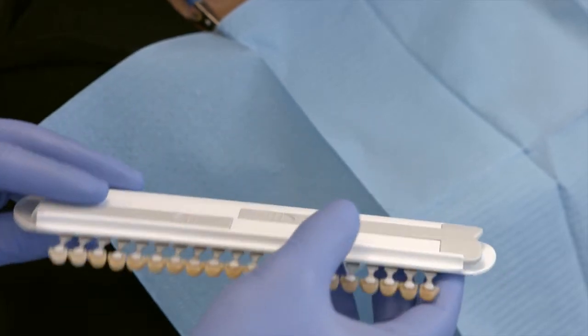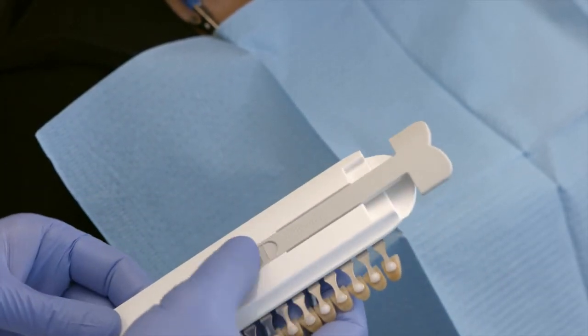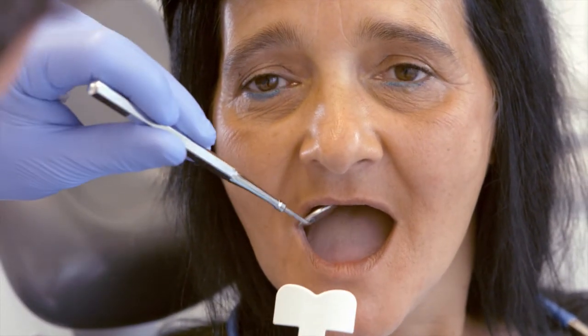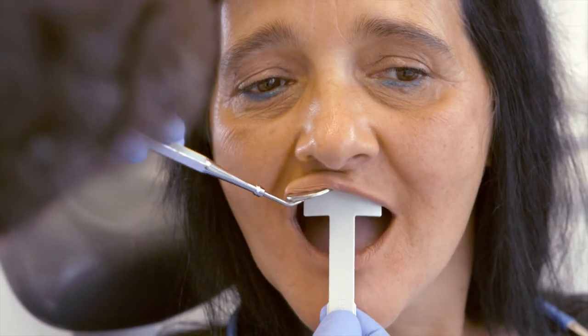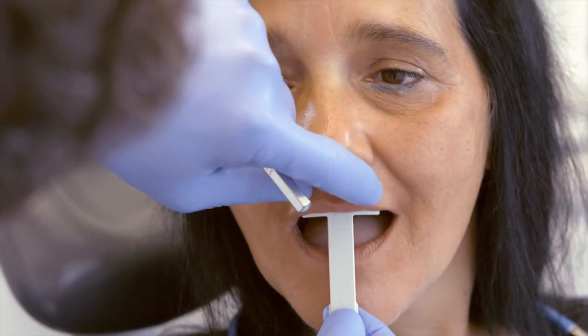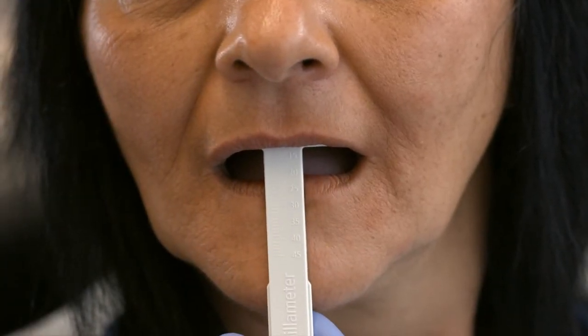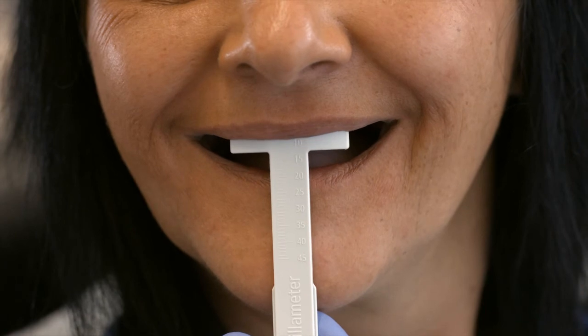Use the papillometer to determine the length of the upper lip and the lip closure line. Position the papillometer on the papilla incisiva and then determine the length of the patient's lips, first when the upper lip is relaxed, and then when the patient smiles. This value allows you to draw conclusions regarding the length of the anterior teeth.